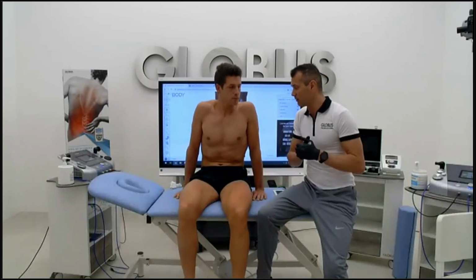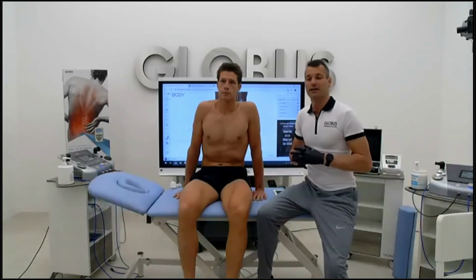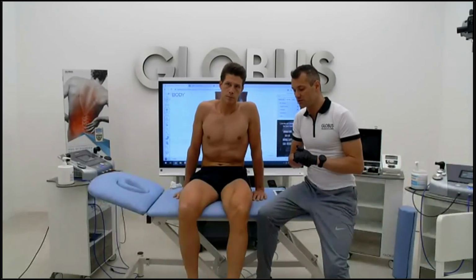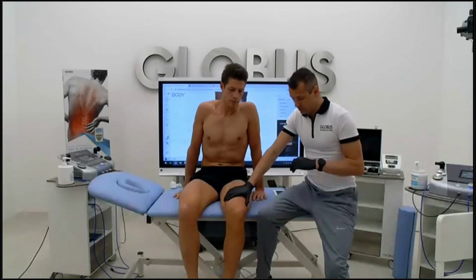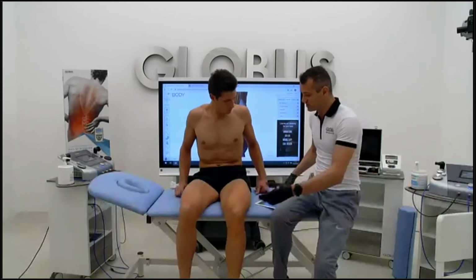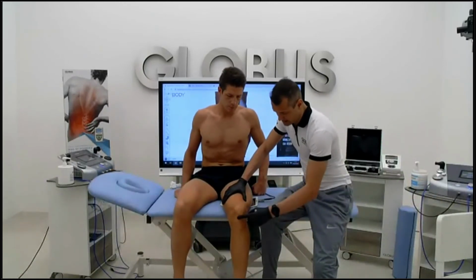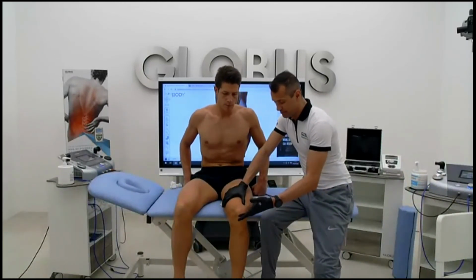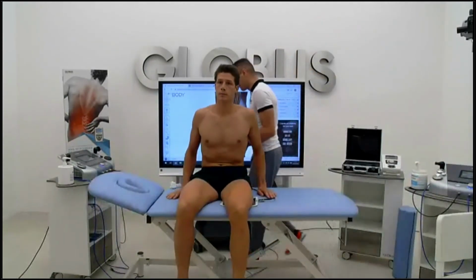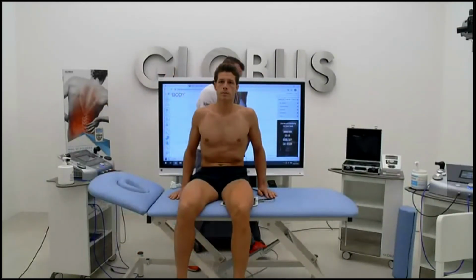And in the next webinar, we will also see on the shoulder how to use the tools to mobilize and not only to treat the tissue. This is another way of using the tools. So in this case, we already did it last time actually, but if you want to use the automatic treatment on the patellar tendon, imagine that we have several possibilities. We can use, for example, the plates here.